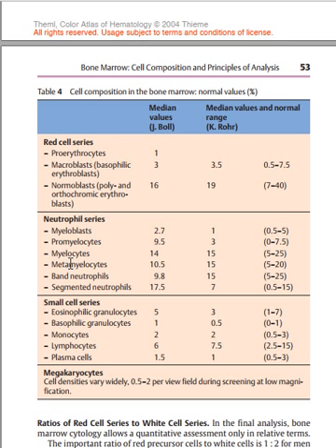But when they are late, you can distinguish them because of their granulation, the cytoplasm. Neutrophil is going to have a clear cytoplasm. Eosinophil is going to have a pinkish, eosinophilic cytoplasm, and basophil is going to have a basophilic, bluish cytoplasm.